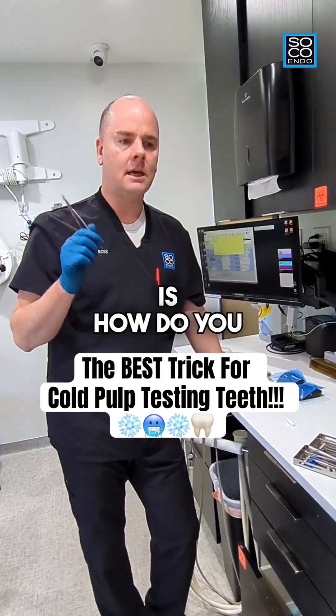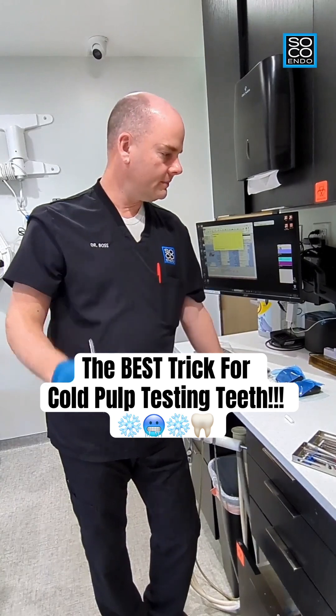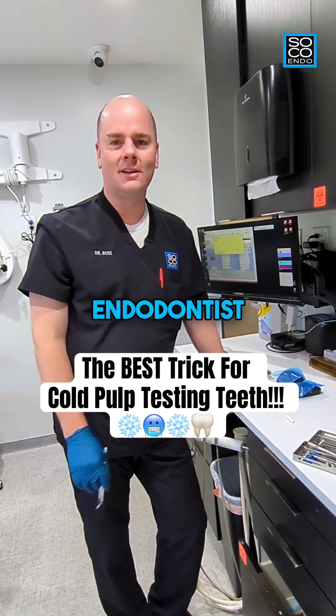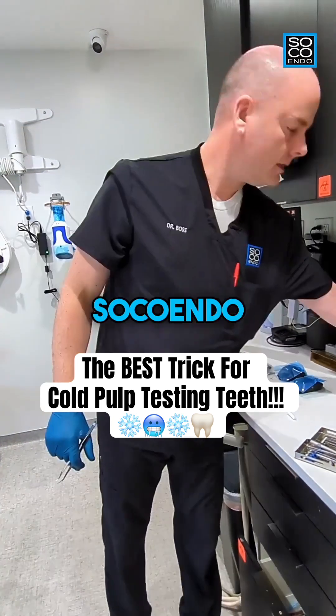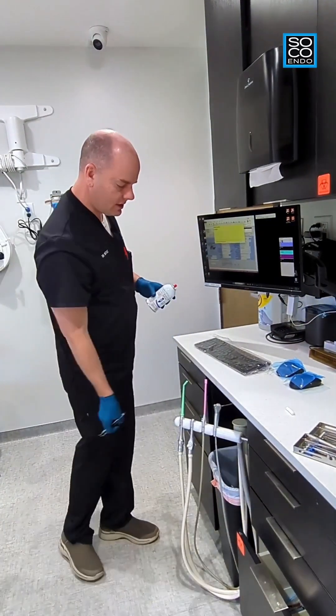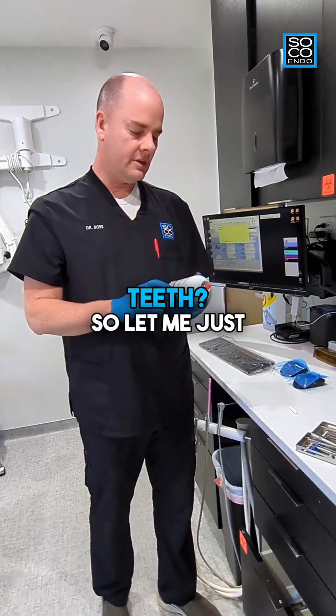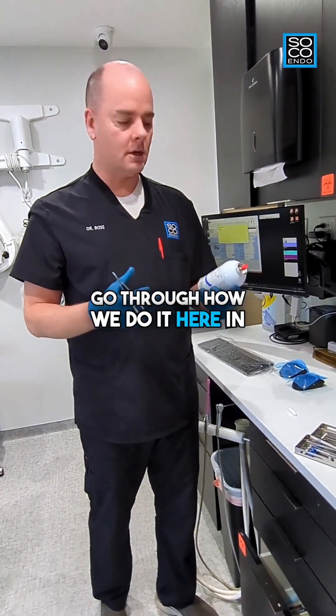Question of the day is: how do you pulp test teeth specifically with cold? Hi, I'm Dr. Boss, board-certified endodontist, owner and founder of SoCo Endo. This is a question I actually get quite frequently from a lot of colleague dentists — what's the best way to cold test teeth? So let me go through how we do it here in our office.